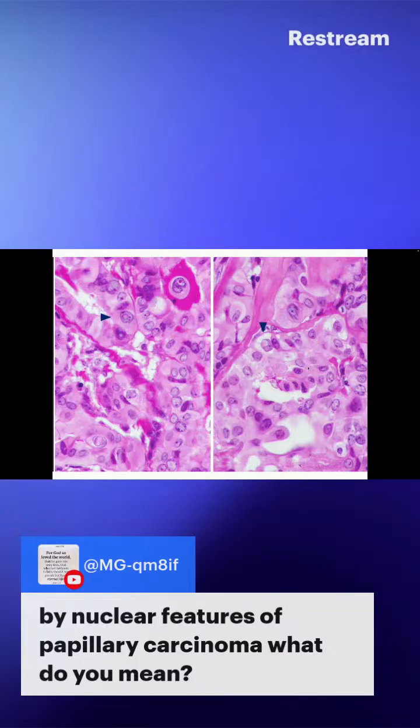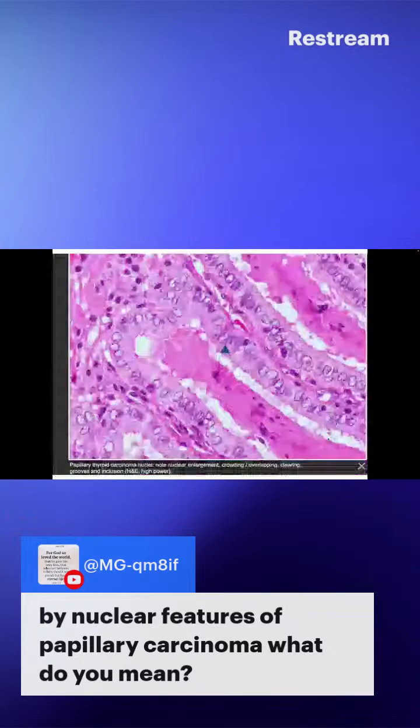If you can see also, I'm just looking for the grooves. No, there are no grooves here. Yes, here is a better one. You can see a coffee bean shaped nucleus, like there's a groove in here. Here also, when you see it, you can't just unsee it. Here, here as well. And let's look for inclusions. Are there any inclusions? I don't think so in this picture.